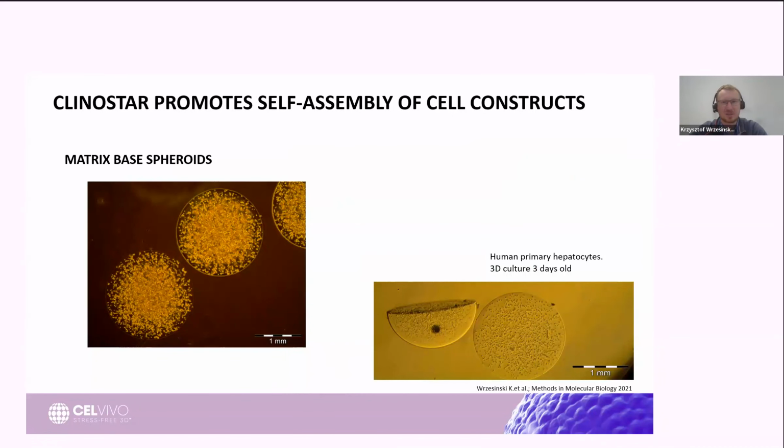And I would say that hydrogel matrices are very useful when we would like to produce constructs made out of cells which completely do not like to stick together, or the ones which stick too much, and you would like to control the number of them, and also control the matrix components. And here is a picture from one of our publications where we use a so-called two-component gel, Q-gels, to produce very nice and uniform constructs.